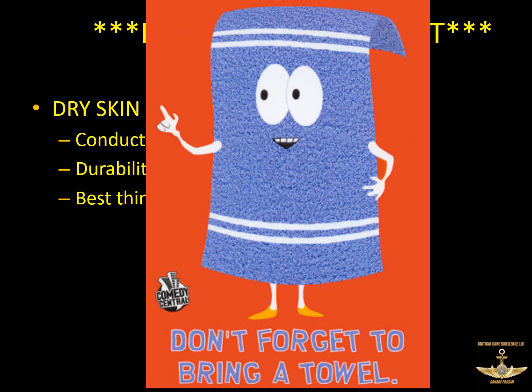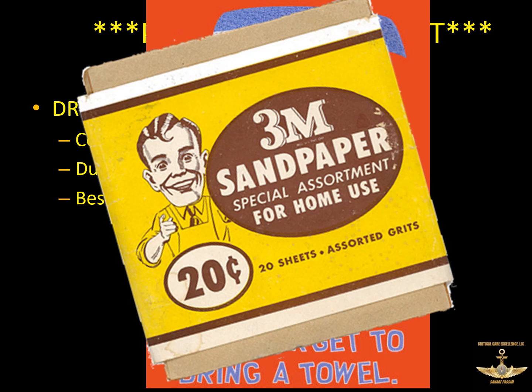And if you happen to use hospital towels, as most of us do, they tend to be pretty abrasive. So you can use a hospital towel to dry the skin, abrade the skin, and clear away that hair that you trim, so you can do an all-in-one step there for getting a good quality EKG. So once you prep the skin, now you actually have to put the stickers on.